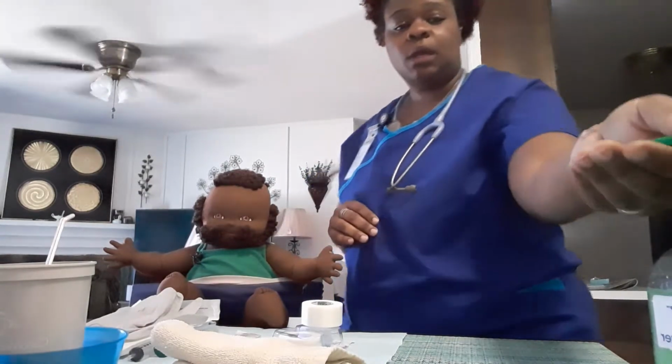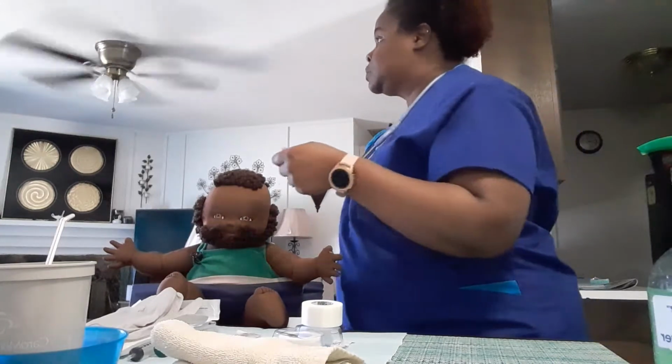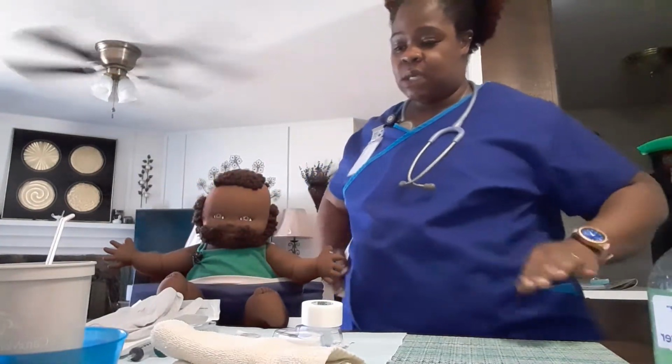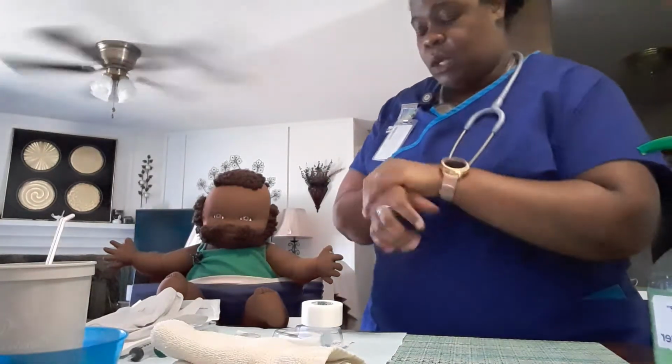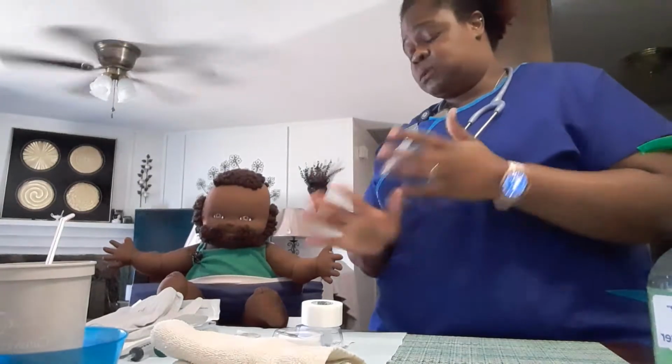And I'm going to go ahead and perform hand hygiene. I'm going to provide privacy. I will pull the curtain. I'm going to raise the bed to hip height. And before I even touch him, I'm still talking to the patient.